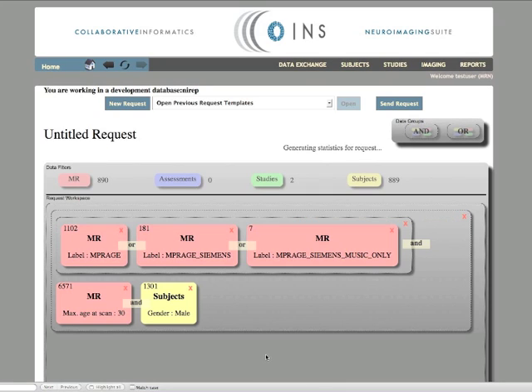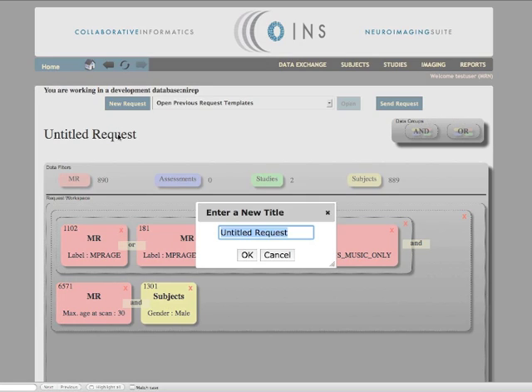The data catalog has found 890 scans across two studies and 889 distinct subjects. In order to keep track of multiple requests, we can change the name by clicking on the label in the upper left corner.